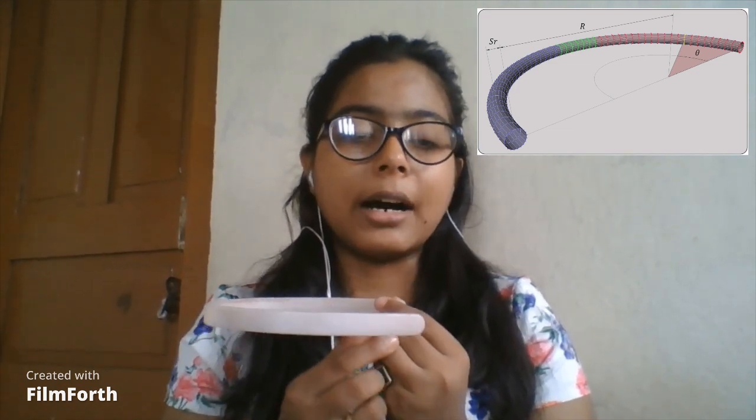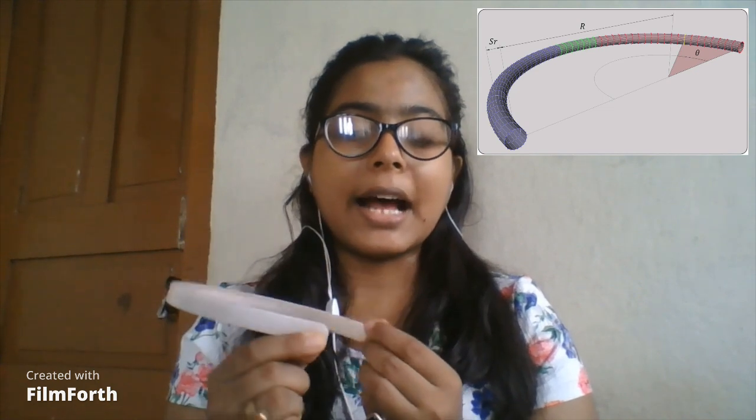theta into a subcluster. So if this is a whole rib, then the part that is visible in the front is the posterior, the part that is in the side is the lateral, and the part that is at the end is the anterior part of the rib. And this is a half torus that has these two poles. Once the subclusters have been formed, they are classified.